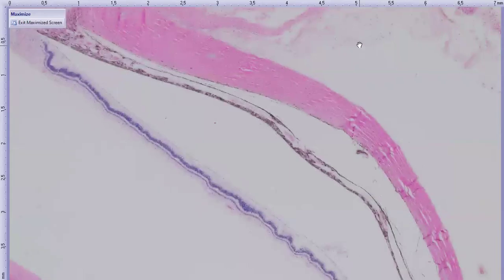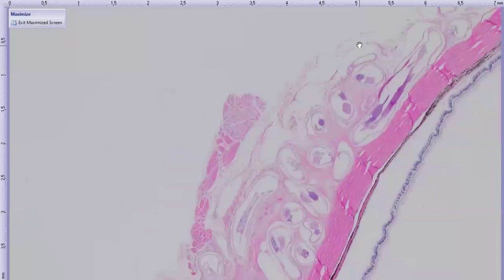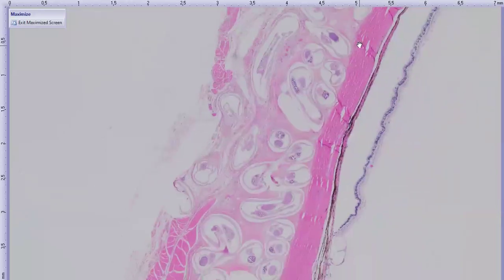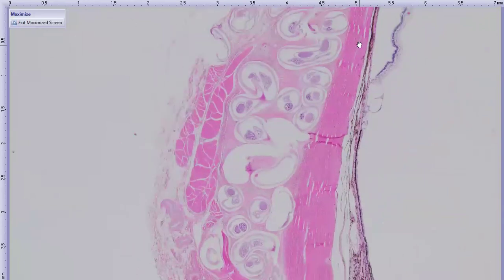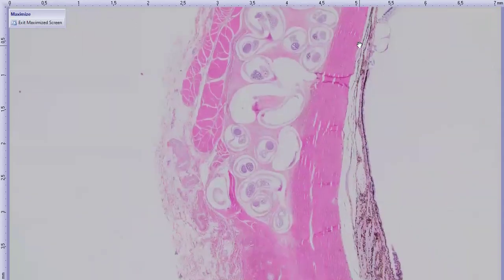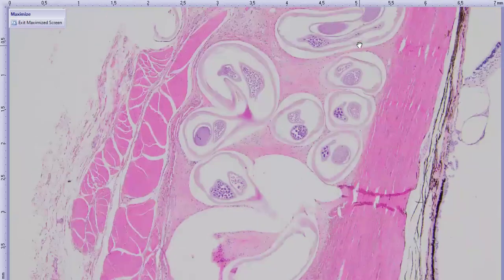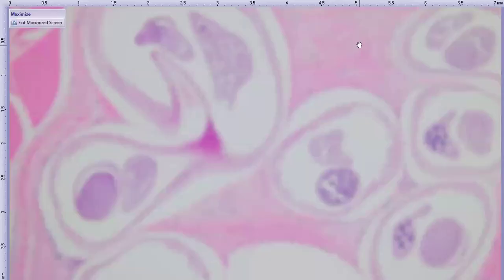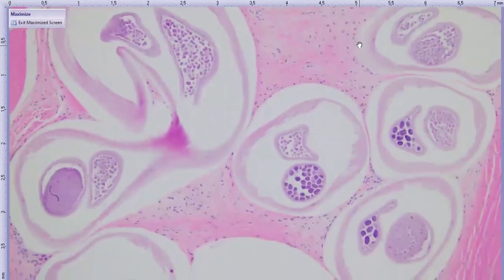And then as an incidental finding, because it is fun, in the left eye, as we're finishing up here, we found some nematode friends in the episclera here. So not a whole lot of inflammation associated, but you can see increased fibrosis.